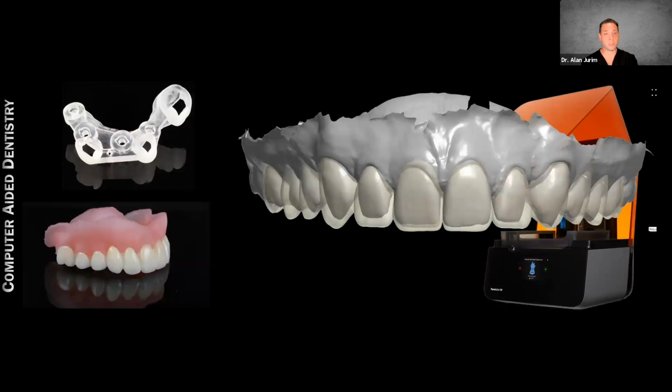Digital tooth setups. What you see here is actually a 3D wax up. I turned the transparency down so you can see the teeth underneath it. But when I say 3D wax up, I hate using that word wax up. I say digital tooth setup now. And this is one of the best parts of how we're using the printer, for really the ability to have a smile designed remotely or a tooth proposal and be able to have that sent to the printer in the practice, take that out and transfer that to a patient and use it for their treatment.